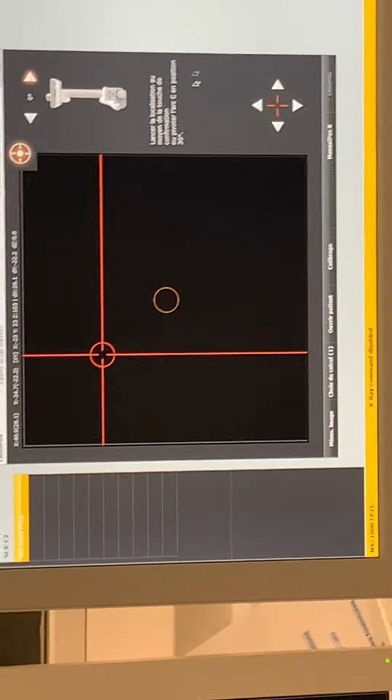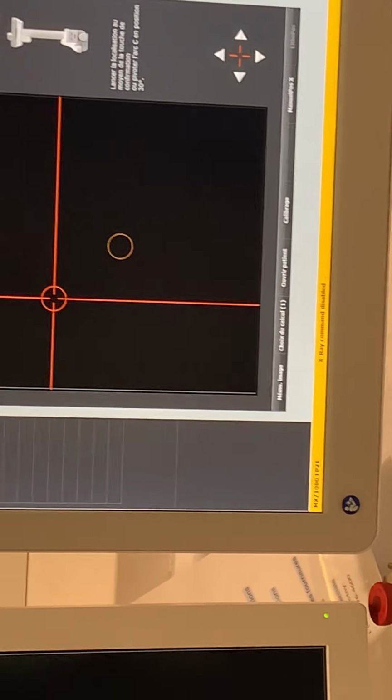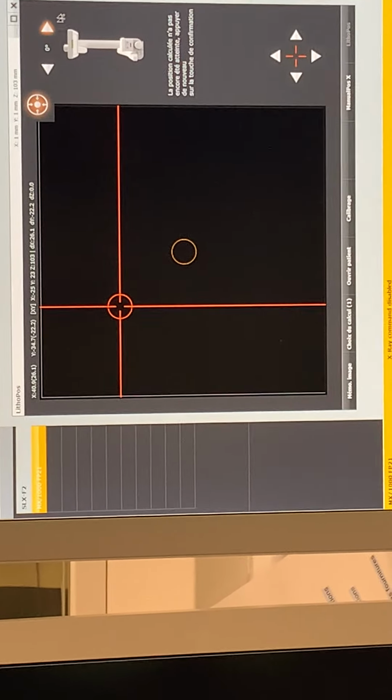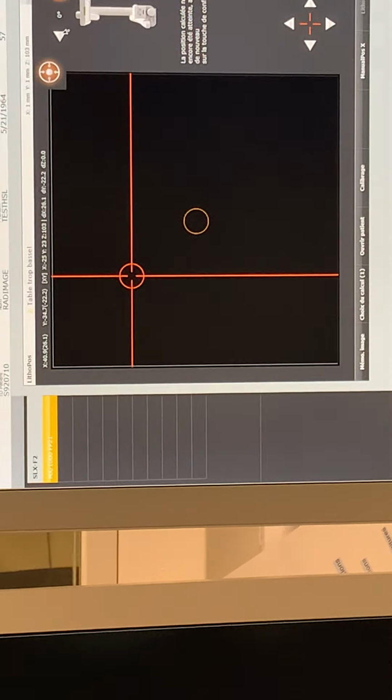So you need the AP and the oblique? Yes, of course, definitely. You need the two axes. You need the 0 degree for X and Y, and you need the oblique for the Z axis. You're going to show us how to put the oblique? Yes, of course.